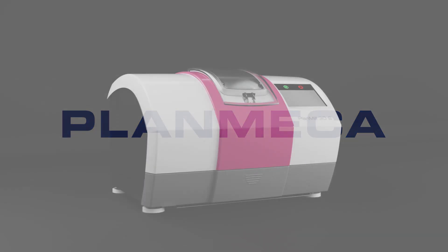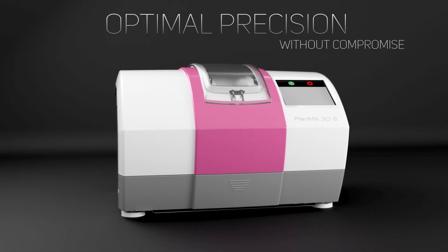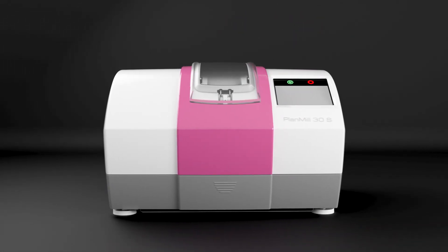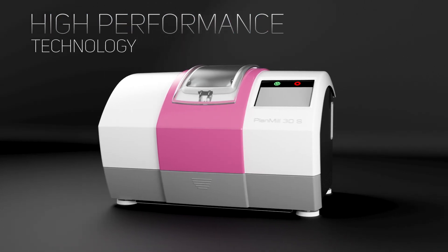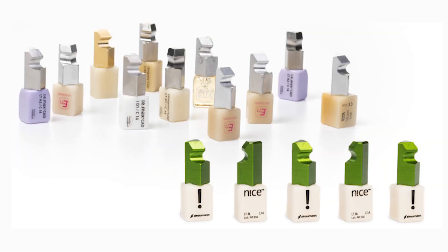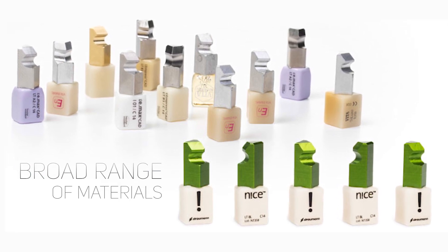Planmeca PlanMill 30S, designed for optimal precision without compromise. A fusion of high-performance servo motor technology creates a robust platform capable of milling a broad range of materials, providing the best treatment option for the patient.